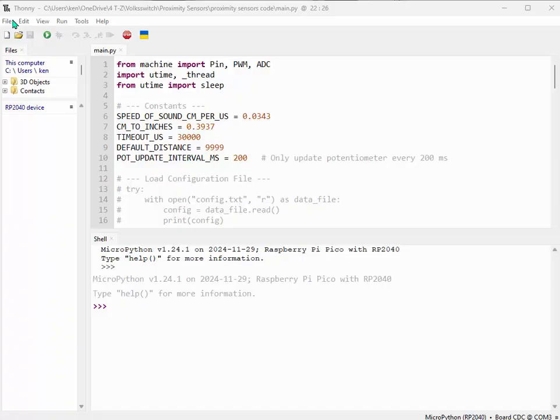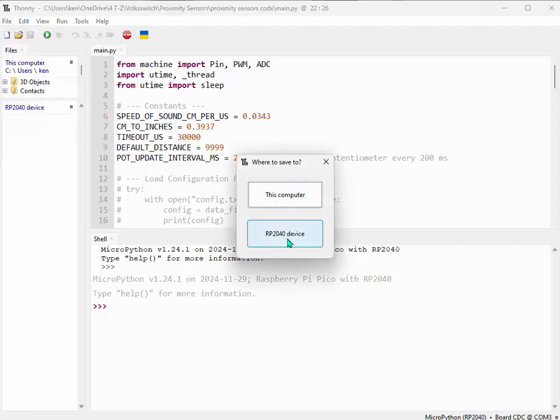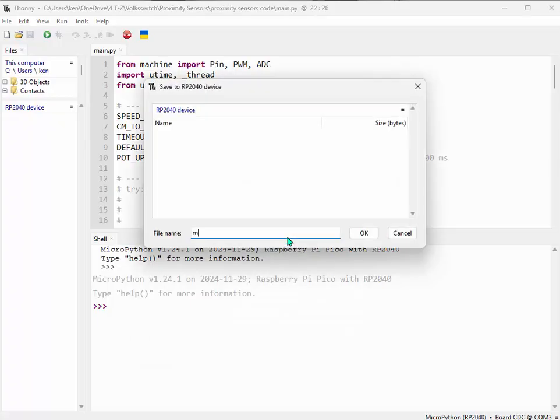All right, we loaded Thonny, and we brought up the main.py, main Python program inside Thonny. And now we just basically need to move it to the Pico, which will involve us clicking Save As, or any one of the saves would work here, but Save As, and we're going to save to the RP2040 device. That's what the Raspberry Pi Pico is. And it needs to have the name main.py.